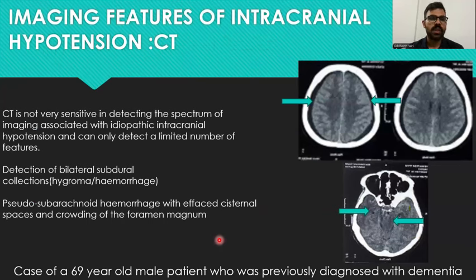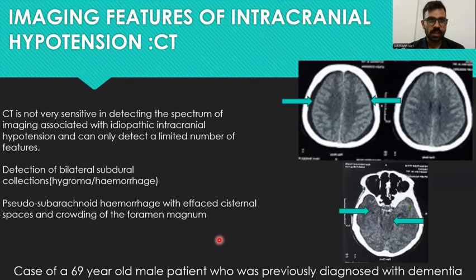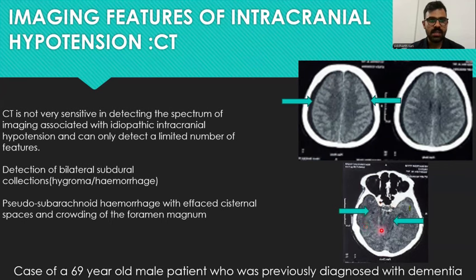Imaging features of intracranial hypotension on CT. CT is not very sensitive in detecting the spectrum of imaging associated with idiopathic intracranial hypotension and can only detect a limited number of features. These include bilateral subdural collections — hygromas or hemorrhages — pseudosubarachnoid hemorrhage with effaced cisternal spaces and crowding of the foramen magnum. This is demonstrated in a case of a 69-year-old male patient diagnosed with dementia.